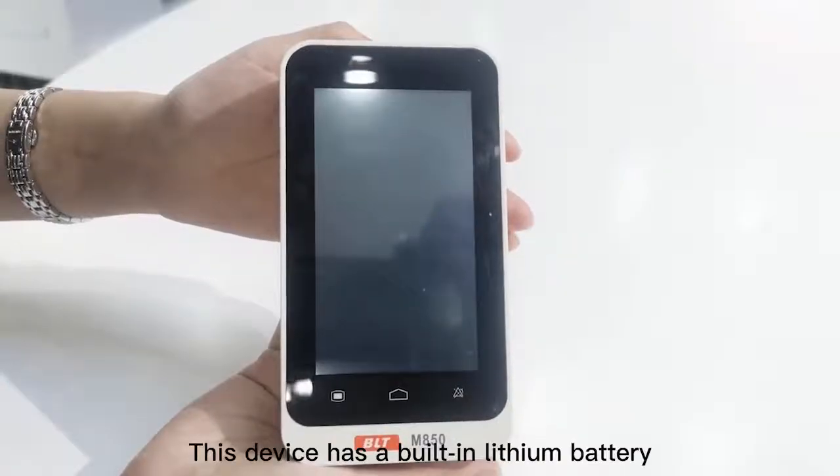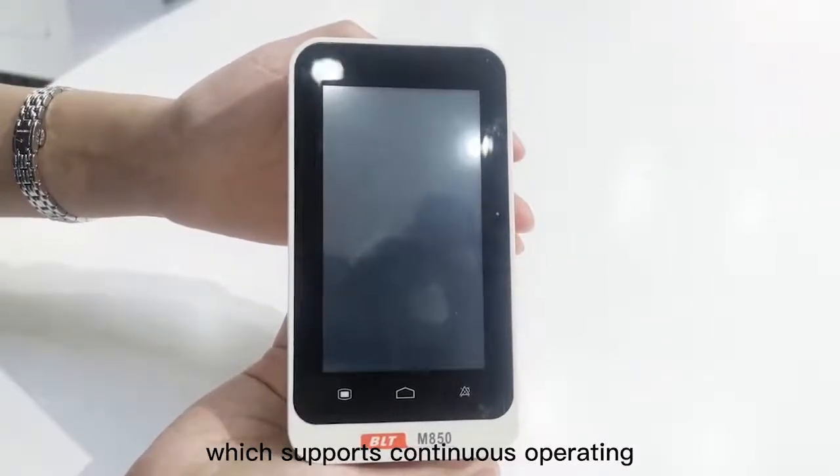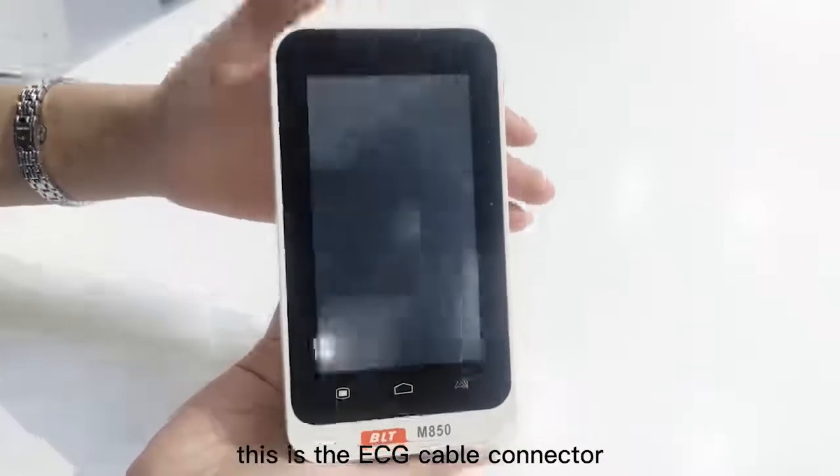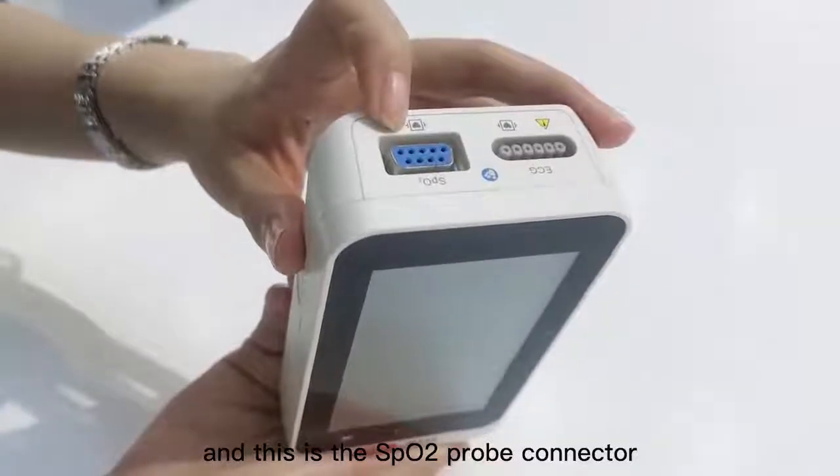This device has a built-in lithium battery, which supports continuous operating for more than 28 hours. This is the ECG cable connector, and this is the SPO2 probe connector.